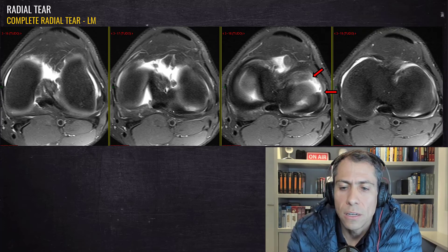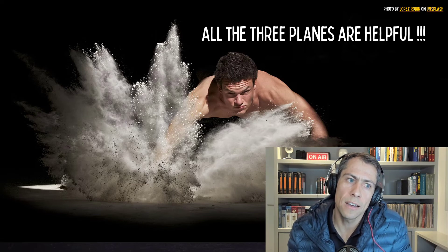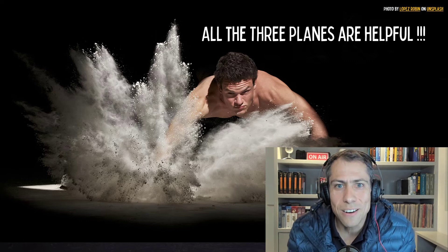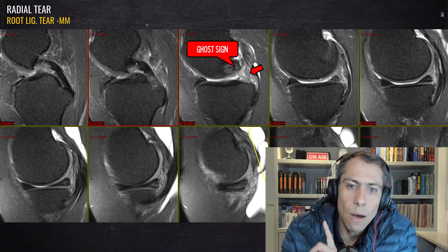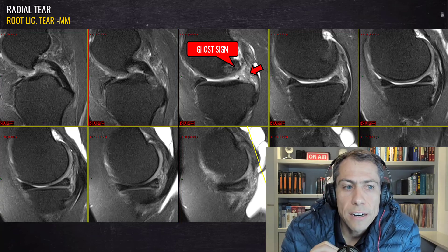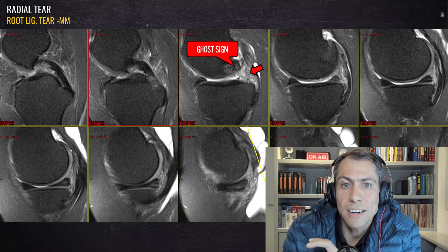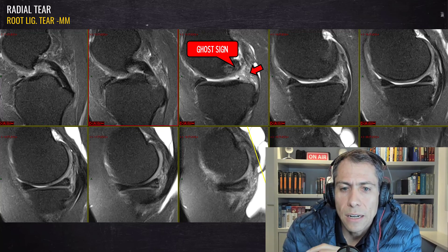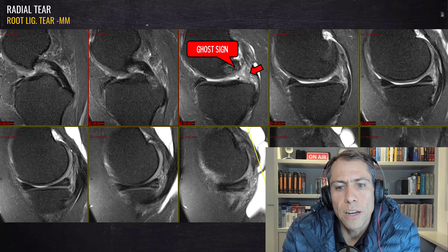The axial plane is very useful for analyzing radial tears. For radial tears, all three planes are helpful, so use everything you have to analyze and report this type of tear. Now let's look at one last case in this video — a radial tear in a specific location: the posterior root ligament of the medial meniscus. This is a classic degenerative root ligament tear, which I'll cover in more detail in a dedicated video.